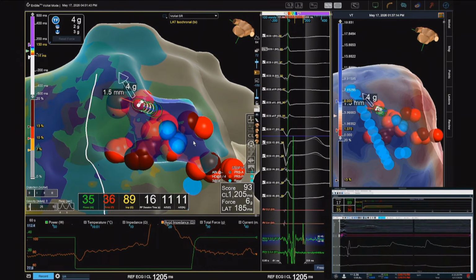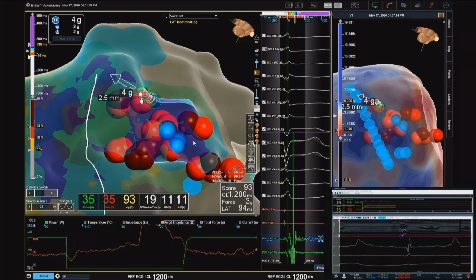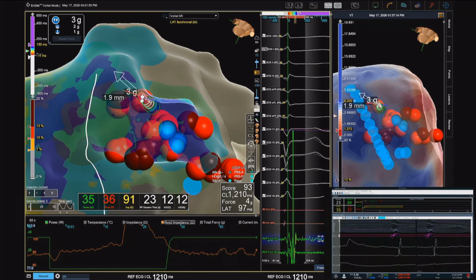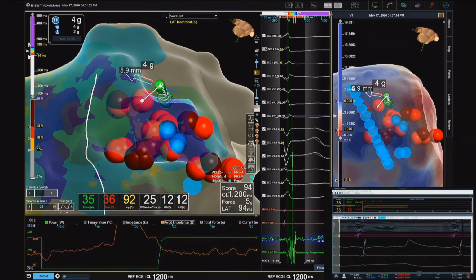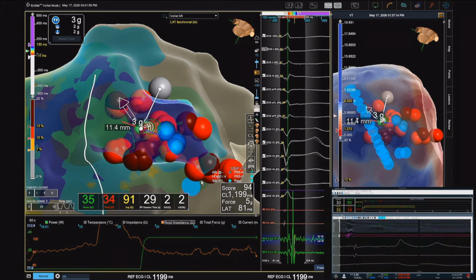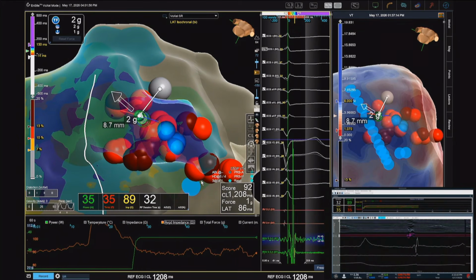Ivo, maybe you can review it and comment also on your experience with the pulsed field energy source. Yeah, true, TactiFlex. We are doing ablations now using a TactiFlex Duo. Yeah, I see it, coming to the area of interest. Okay, again, so we are doing TactiFlex Duo.